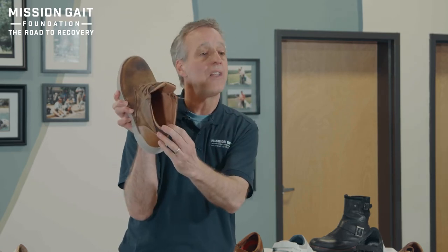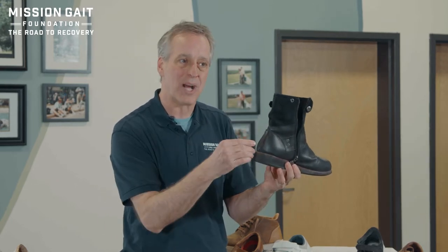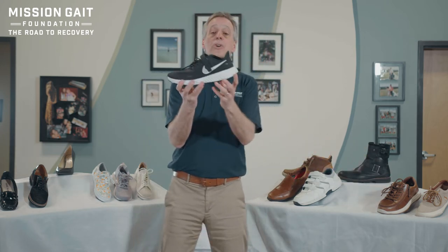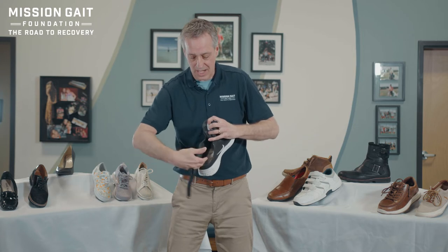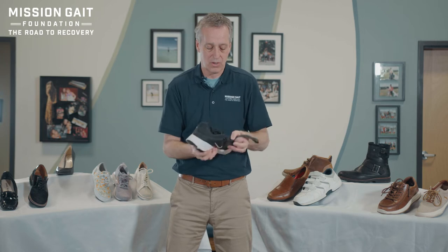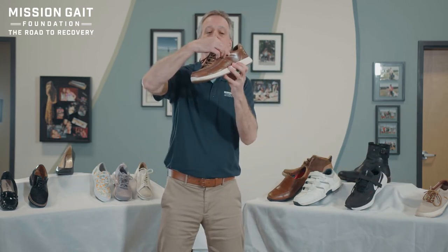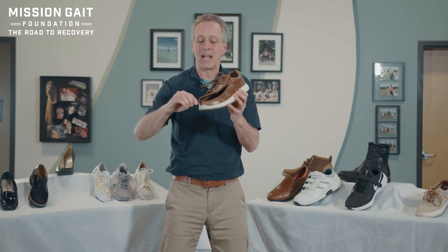Boots are also an option. If a boot opens up well enough on top you can fit an orthotic or prosthetic device down into it. A boot with a zipper all the way down the side can also work. There are even prosthetic cowboy boots made specifically for prosthetics — zipper all the way down the back with a low heel-to-toe drop. Some specialized shoes have a lace-up top plus the ability to unzip and open the entire back of the shoe, letting you slide the orthotic or prosthetic in, zip up, lace across the top, and you're stable. Another version unzips the entire front of the shoe, allowing you to get the brace or prosthetic down in there and then stabilize it.